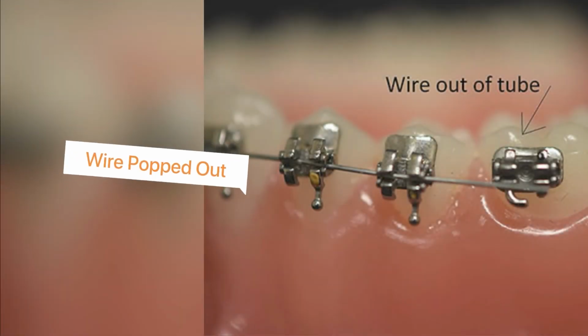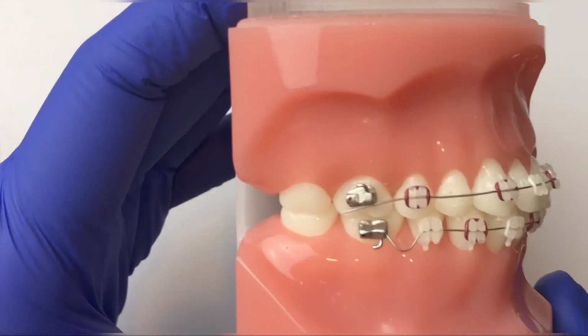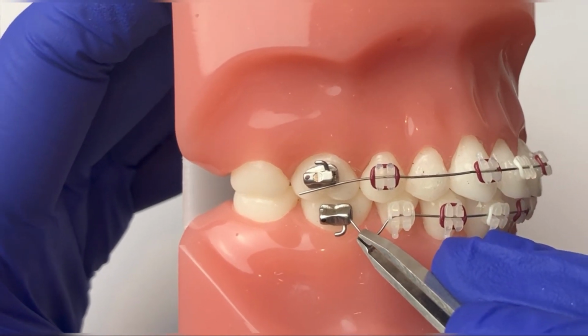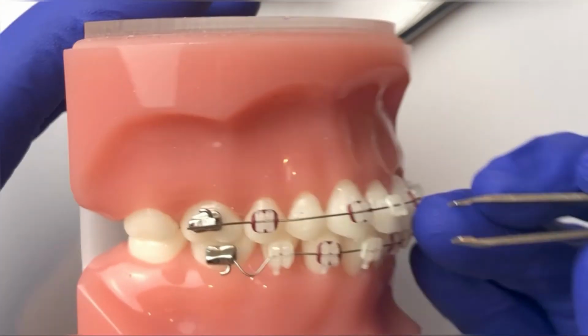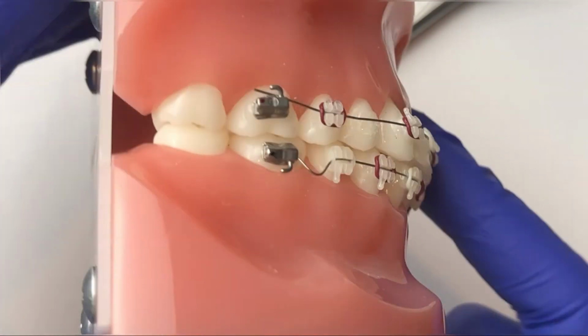If a wire popped halfway or completely out of the last bracket, and you're able to have good visual using the mirror we gave you, you can use a pair of tweezers to insert it back into the bracket. If you're unable to reinsert it, you can try to tuck in the wire above the bracket. It will keep it away from your cheek and buy you some time until you can see us.